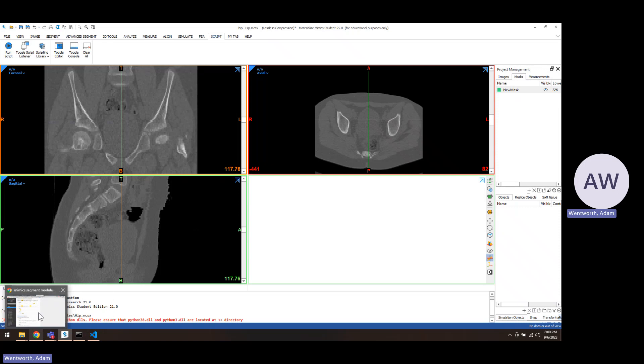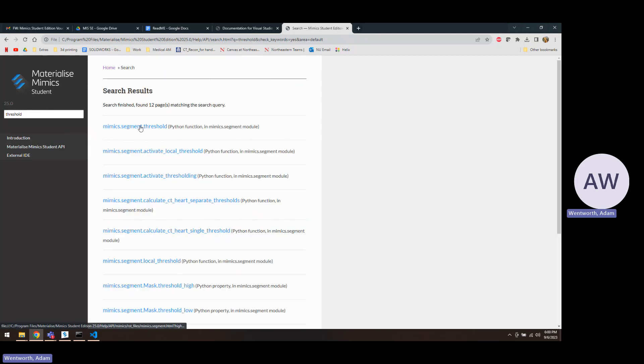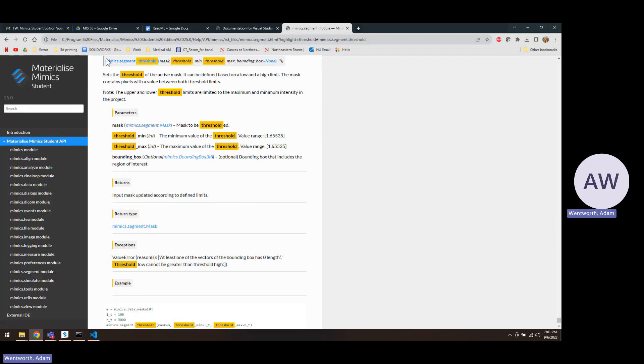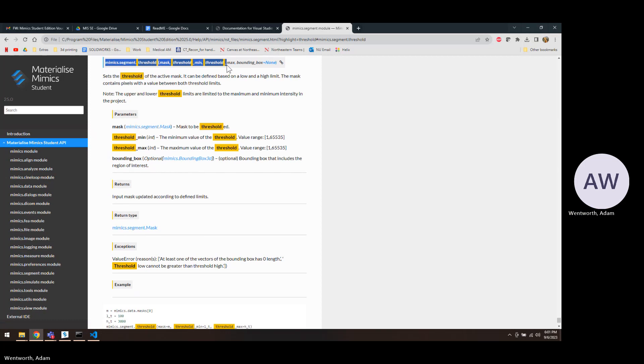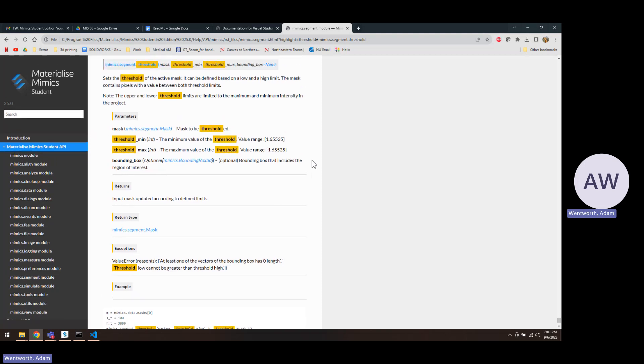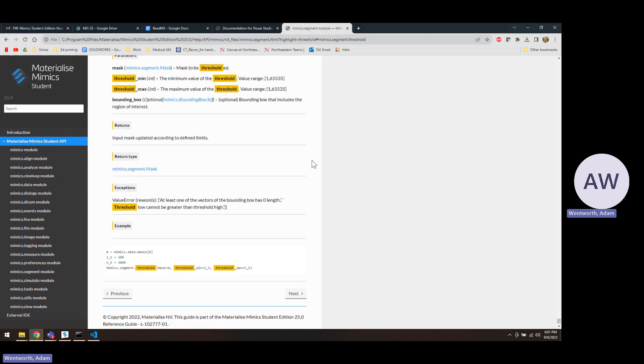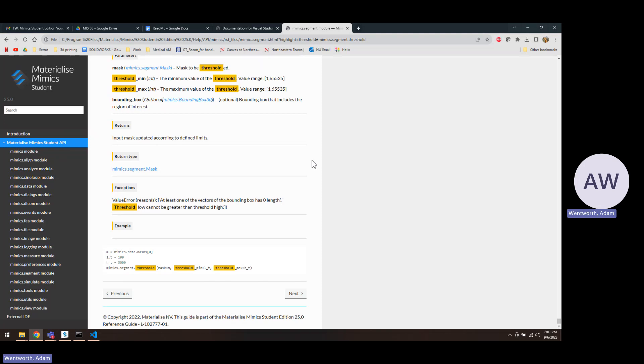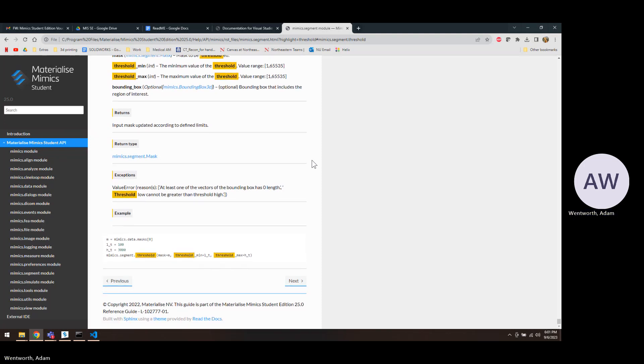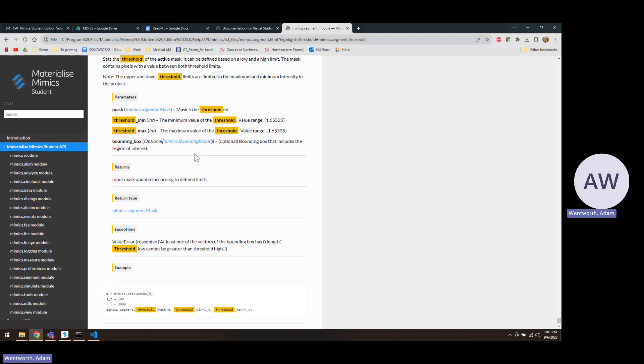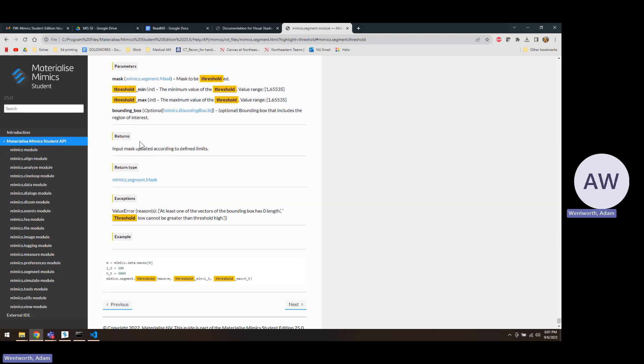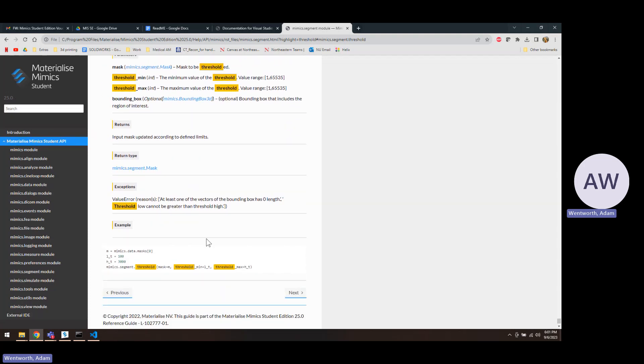There's additional steps for thresholding, which would be probably the first step that you would do after you make a new mask. Thresholding also requires that you do some gray values. Usually these DICOM images are in Hounsfield units, and you need to actually use or you can convert using gray values instead. Typically, you would see an example of the code down at the bottom, which might be a little more easier to understand than the parameters they're just throwing in here. You might not know exactly what to put in there, so you can always look down and find some examples and you can also just copy and paste these in.